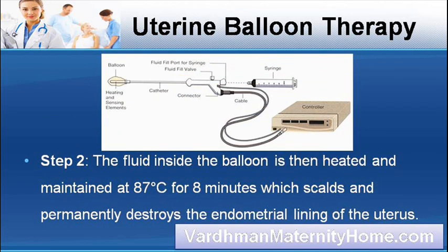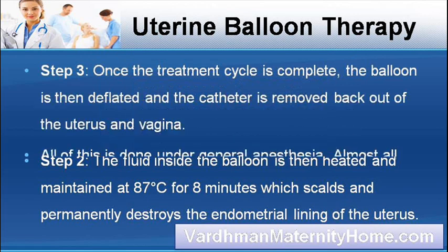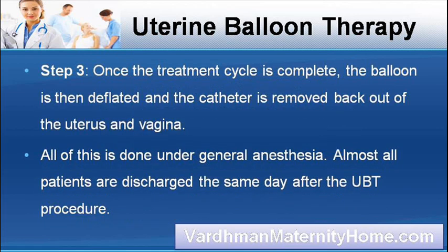The fluid inside the balloon is then heated and maintained at 87 degrees centigrade for 8 minutes, which scalds and permanently destroys the endometrial lining of the uterus. Step 3. Once the treatment cycle is complete, the balloon is deflated and the catheter is removed out of the uterus and vagina. All of this is done under general anesthesia.